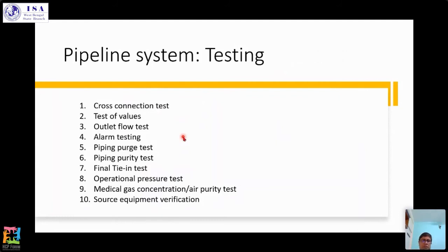We have got connectors in place, but if there is some problem in the initial supply site, or if there is some cross connection between the pipes during repair or faulty construction, there will be no way to know that we are actually getting the wrong gas. So even with all these color-coded and gas-specific connectors, we have to have an oxygen monitoring device at the point of care, when the air is entering the patient's lung. We must monitor FiO2.